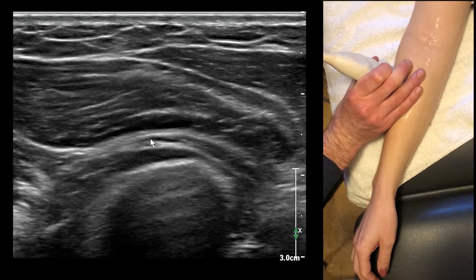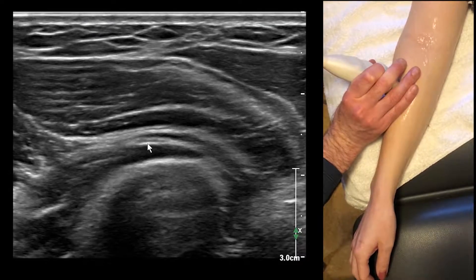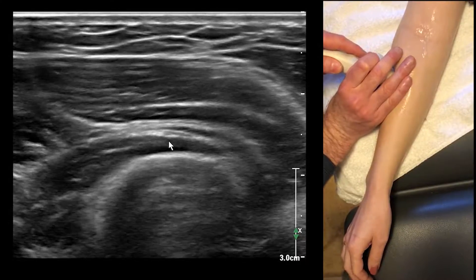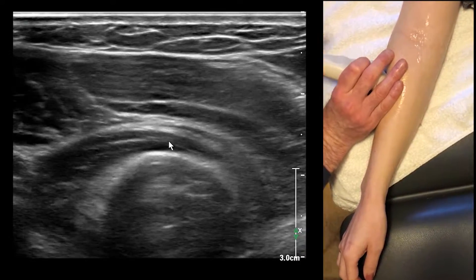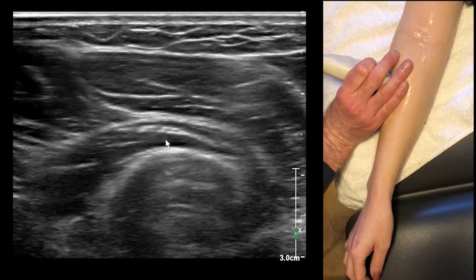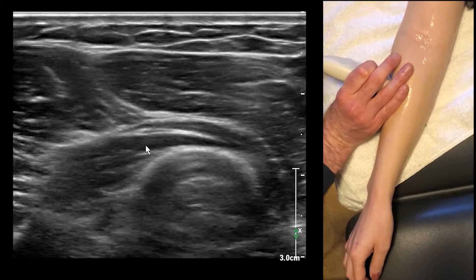I'm just sliding the transducer along here — you can see I'm getting a little bit oblique to it. Follow it — here it is right here. Here we are between the two heads: the superficial and deep head of the supinator.